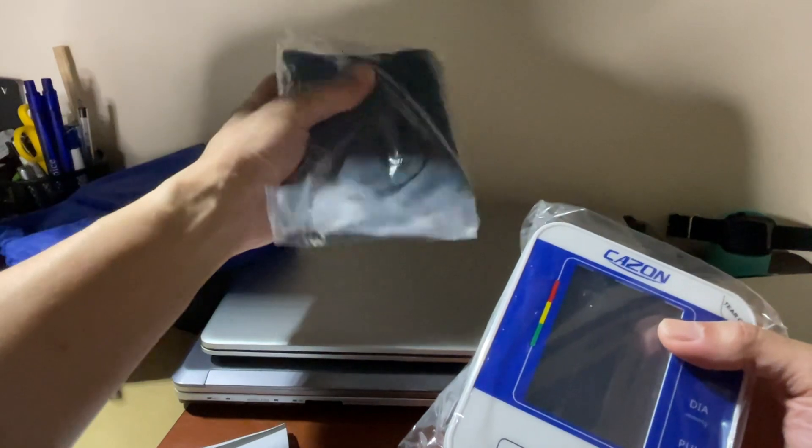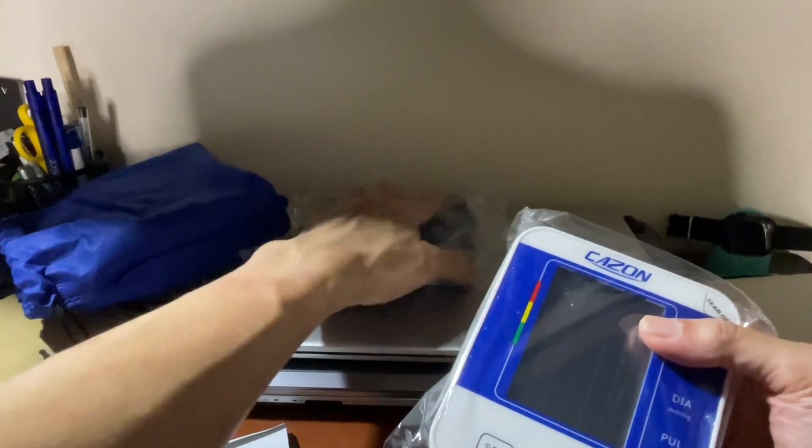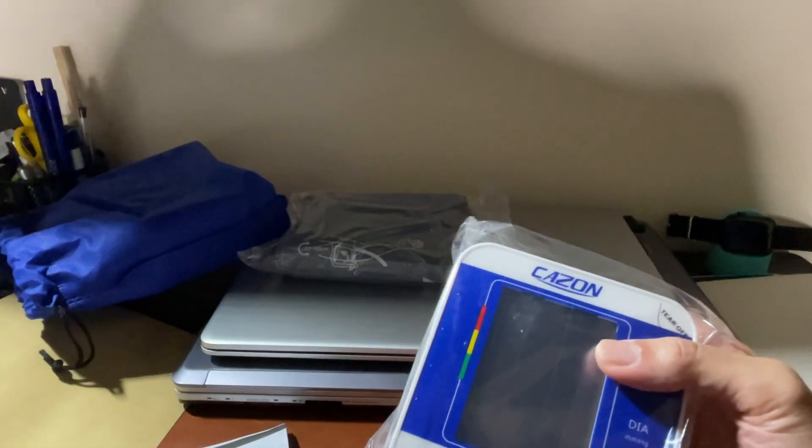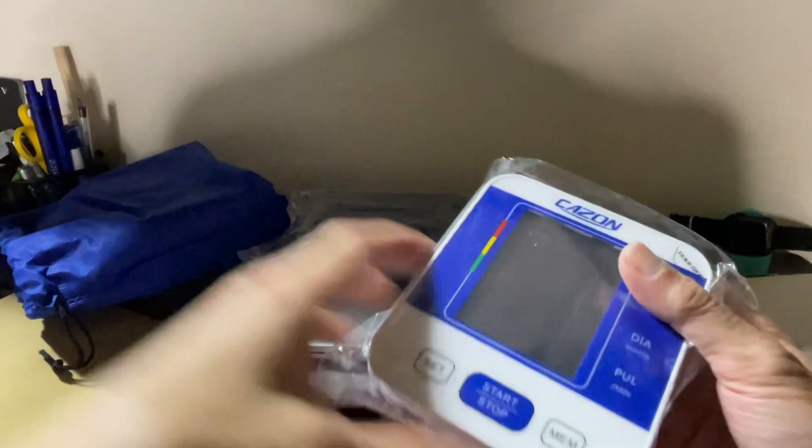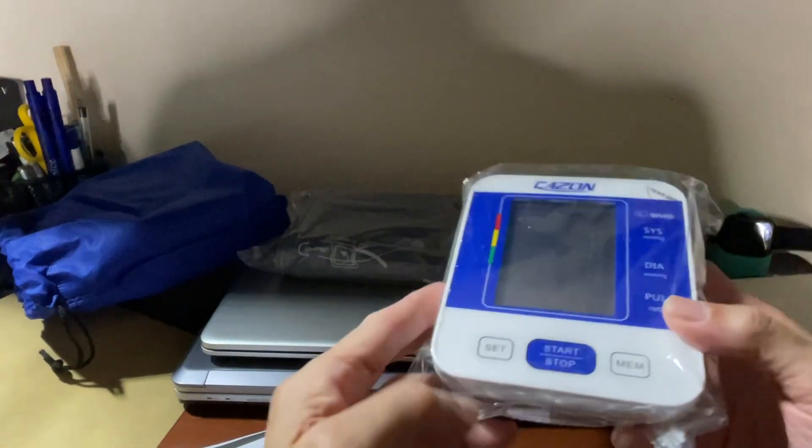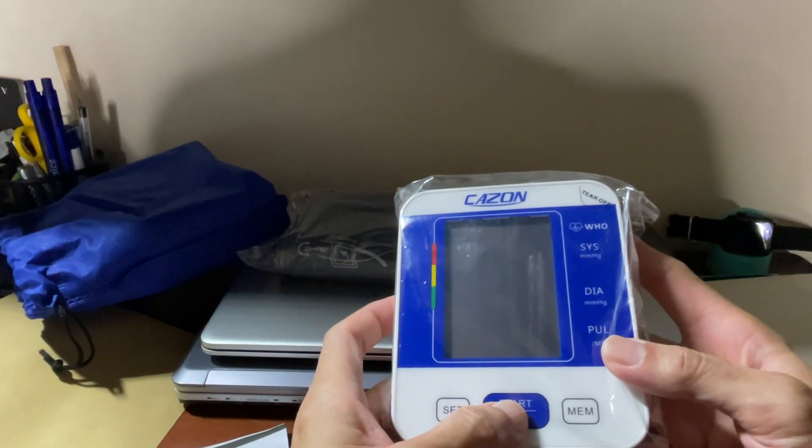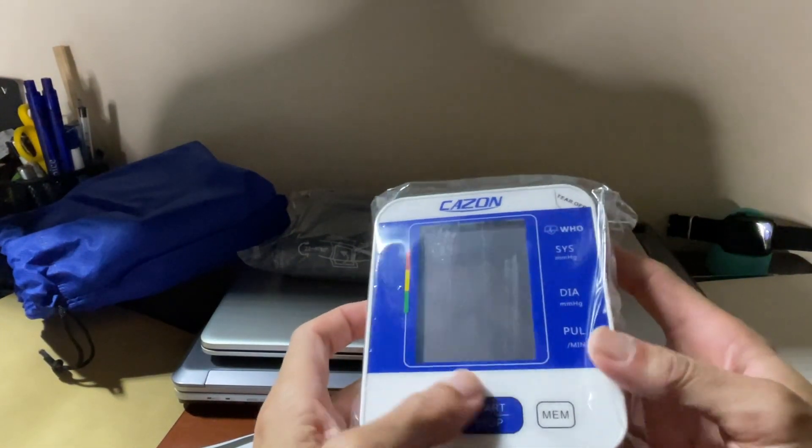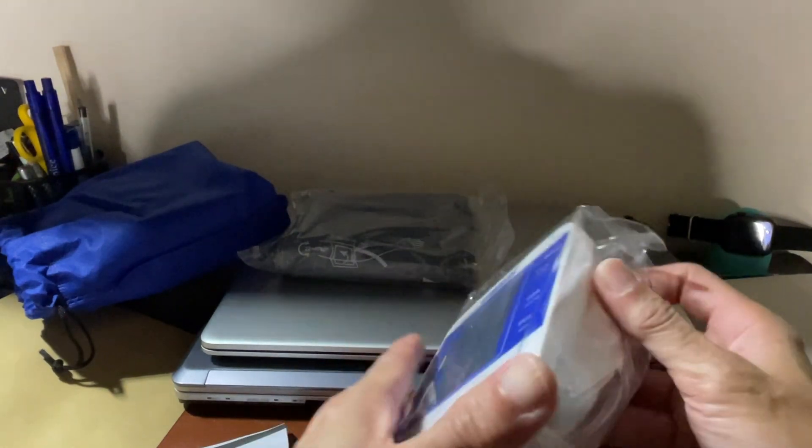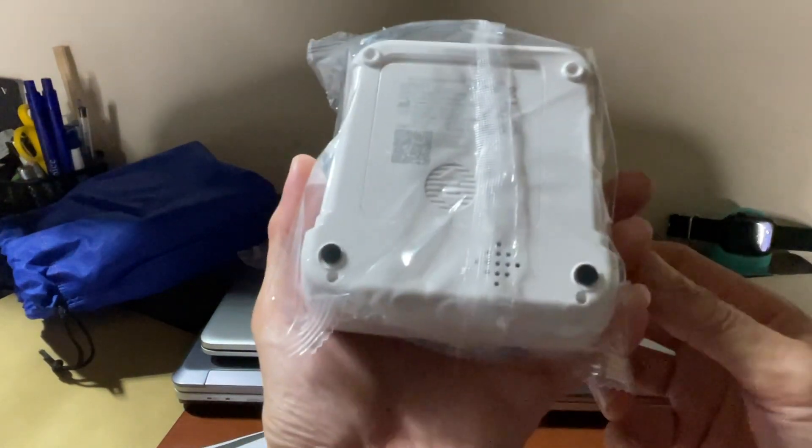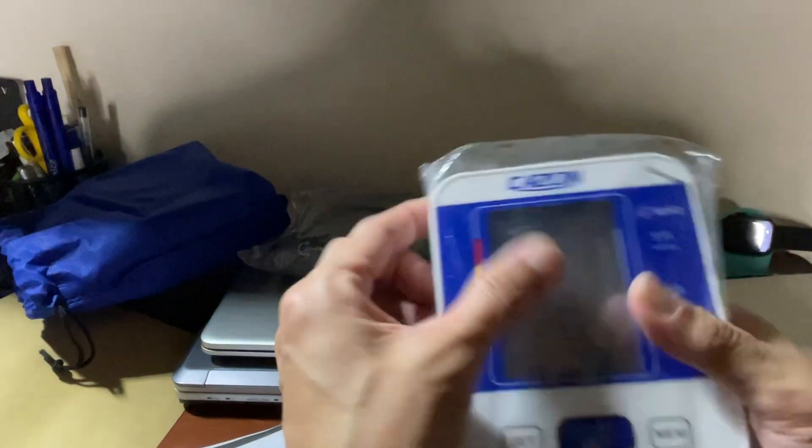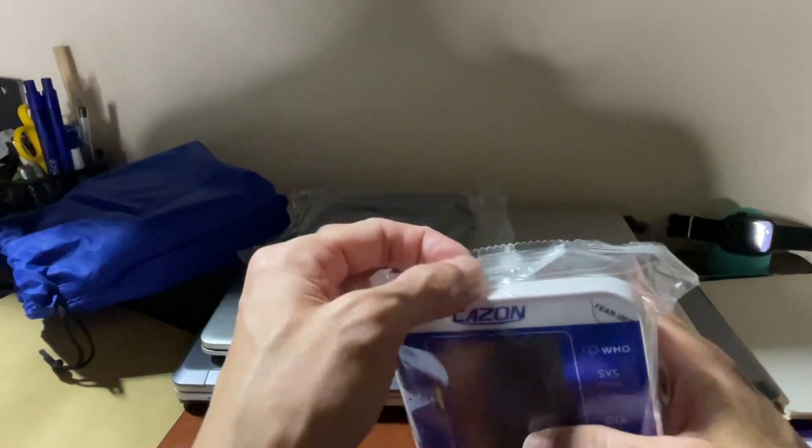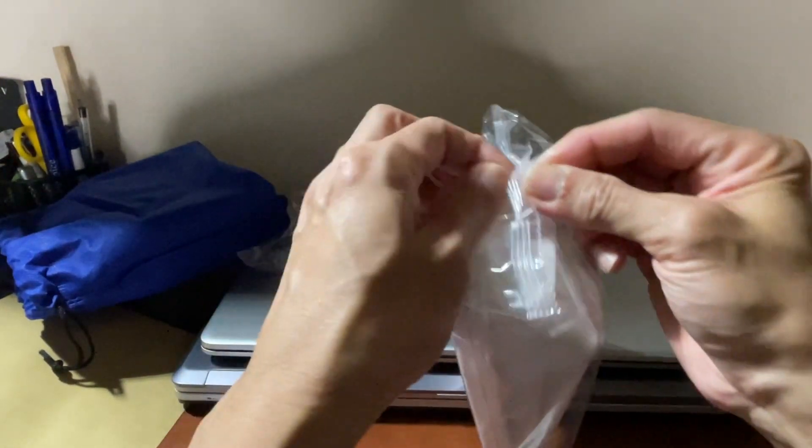By the way, some blood pressure monitors come with a battery on it, and I think this one doesn't have a battery on it. Let's open it.